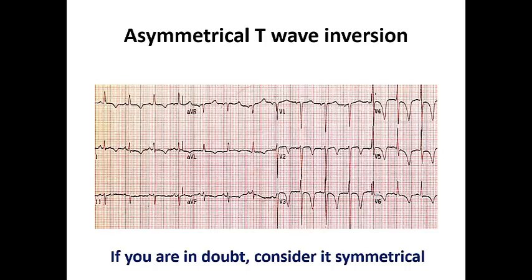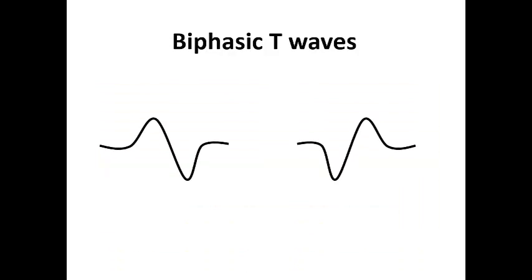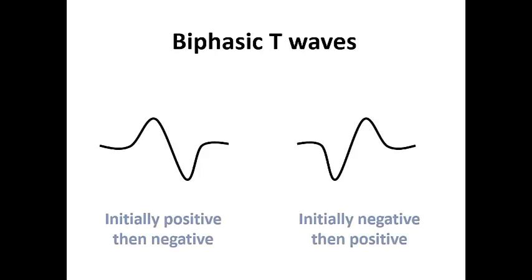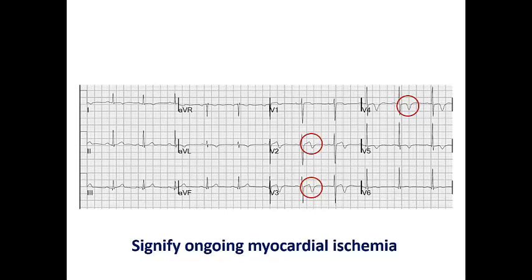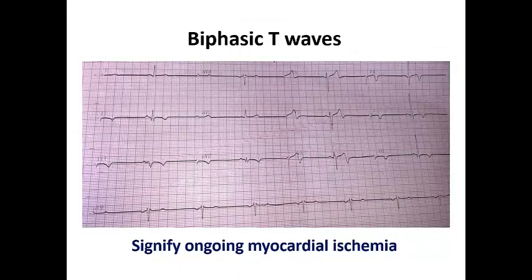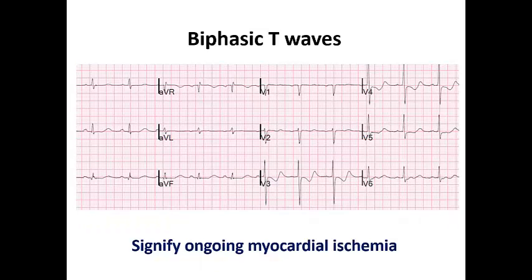The biphasic T-wave has two morphological variants: either starting positive then turning negative, or starting negative then turning positive — both are considered biphasic T-waves. In this ECG example the patient has biphasic T-waves in V2, V3, and V4, suggestive of ongoing myocardial ischemia in a patient presenting with chest pain. Biphasic T-waves are very important to recognize and are as clinically significant as symmetrical T-wave inversion.